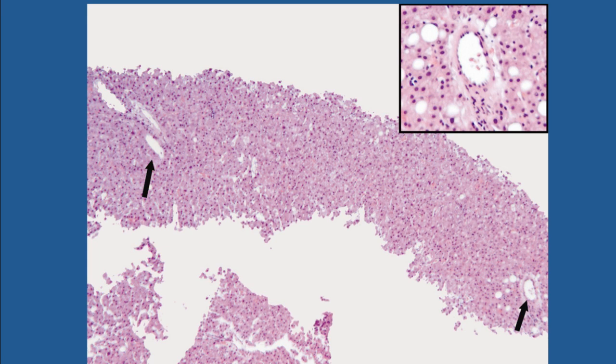This is abnormal. And it turns out that this was a biopsy taken from a mass lesion, and therefore, this is a hepatocellular adenoma. This is not normal liver. So what I'm trying to get at is that when we are assessing the architecture of the liver and we try to see whether it's normal or abnormal, you cannot rely on the graphics that we have seen because those are not highlighted on an H&E stain. So what we are looking for is the regular occurrence of portal tracts and central veins in the biopsy.